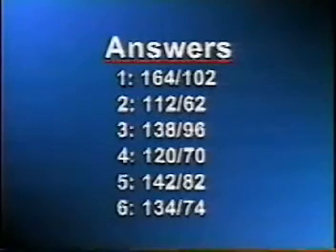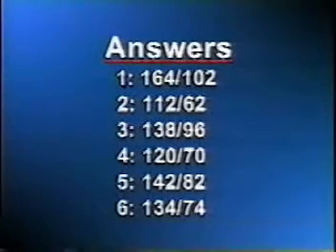Now, compare your recorded measures with the answers. If any single measure differs as much as plus or minus 4 millimeters of mercury, you should repeat the entire test section of this tape. You may wish to refer to the manual or other parts of this tape for clarification of the technique.